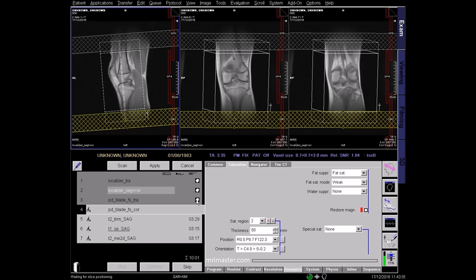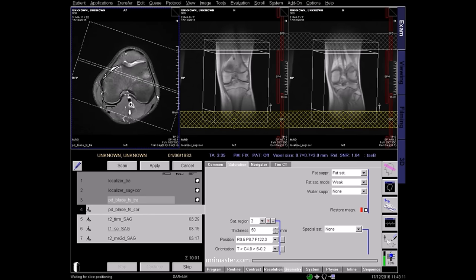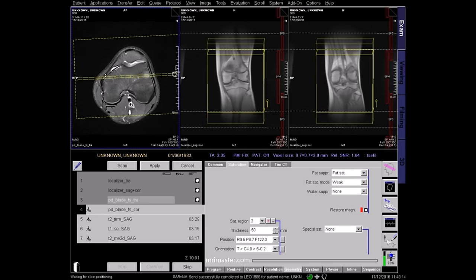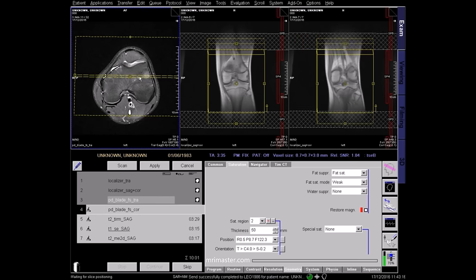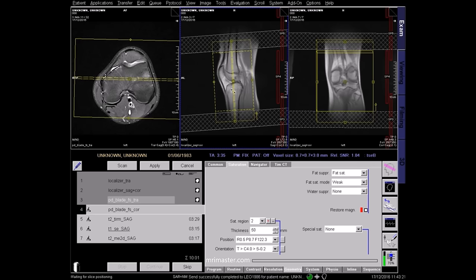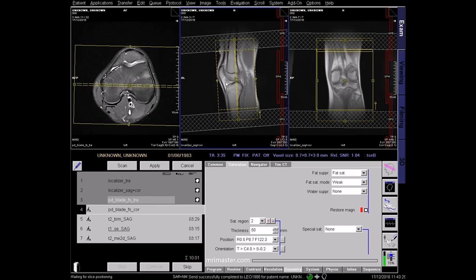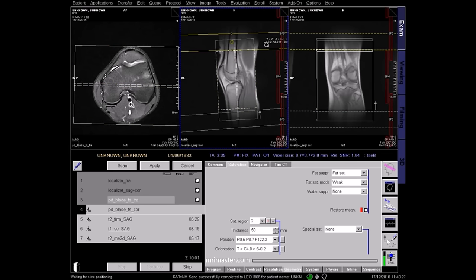Next, plan your PD fat saturated coronal sequence on the newly acquired axial image. Slices should cover the knee joint from the patella anteriorly to the popliteal artery posteriorly. Slices should run parallel to the posterior border of the femoral condyles. On the sagittal view, the slices should be planned parallel to the midline of the femur and tibia. Again, use saturation bands above and below to reduce pulsation artefacts.